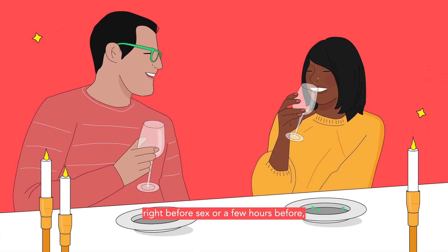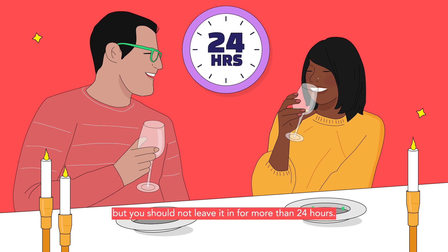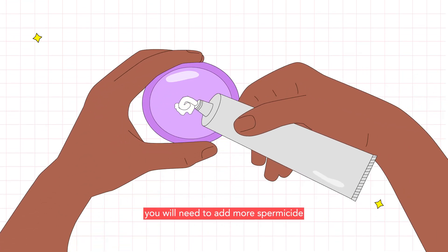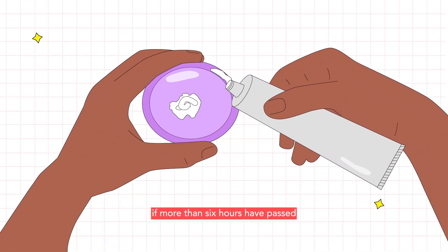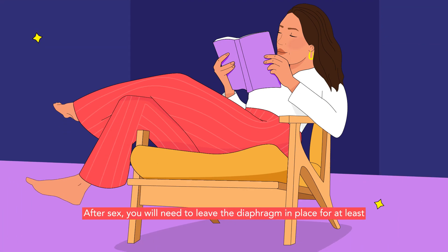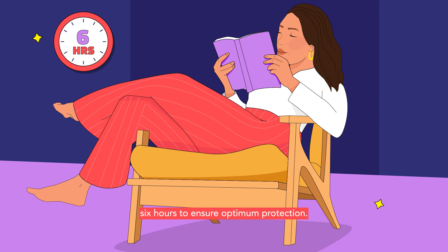You can insert a diaphragm right before sex or a few hours before, but you should not leave it in for more than 24 hours. If you have sex more than once within this time, you will need to add more spermicide if more than six hours have passed since the last sexual act. After sex, you will need to leave the diaphragm in place for at least six hours to ensure optimum protection.